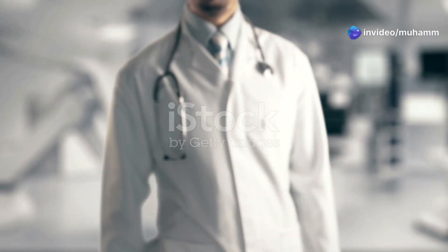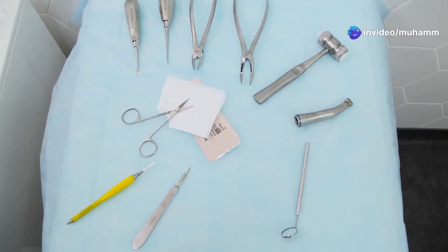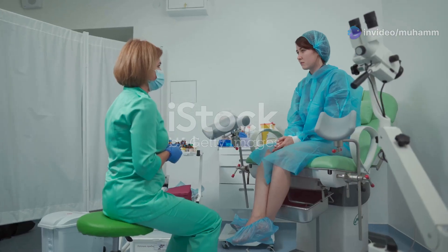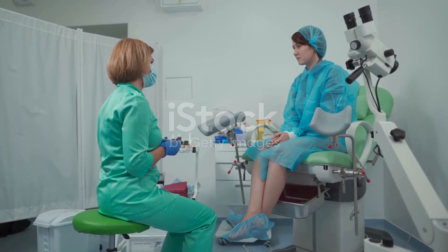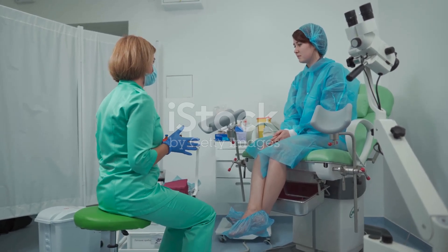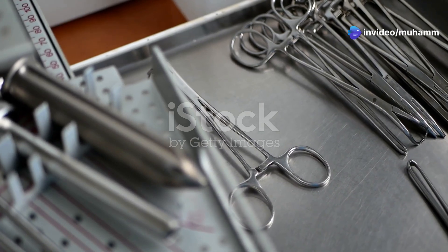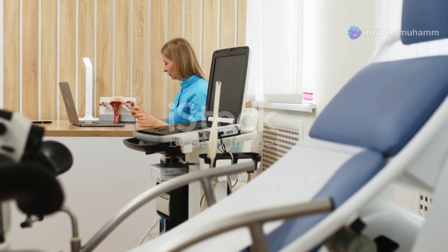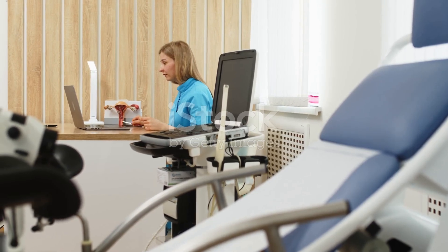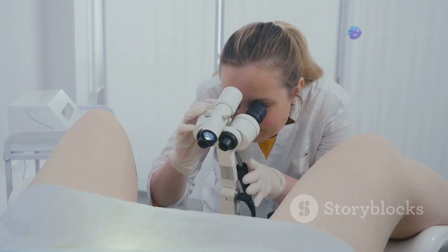Today I'm breaking down everything you need to know about the vaginal speculum. Understanding this tool is crucial for any healthcare professional working in gynecology or general practice. A vaginal speculum is an instrument used to gently open the vaginal walls, providing a clear view of the cervix and vagina during examinations, allowing for better assessment, diagnosis, and treatment.